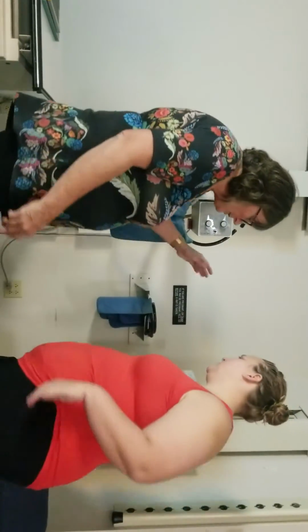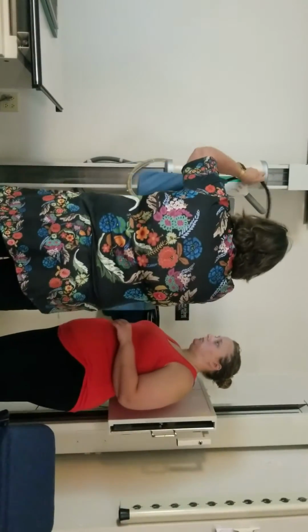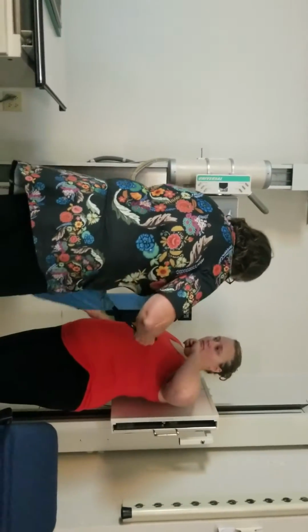Nope. How'd they do on ID, guys? Did I do okay? All right. So we're going to position her just like we did with the shoulder. I put this in the way, so I have it in the way.